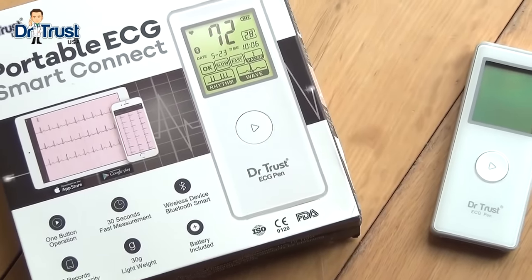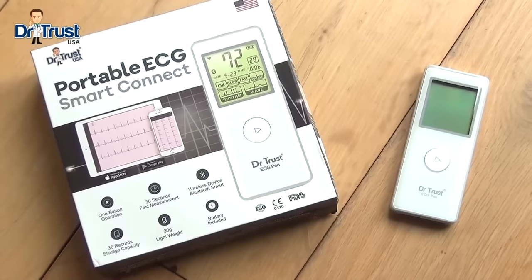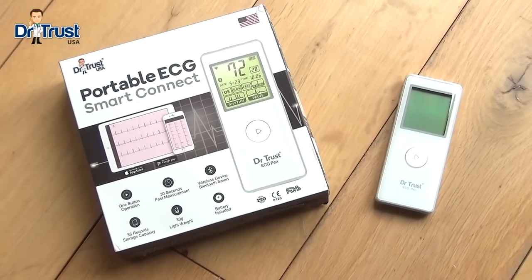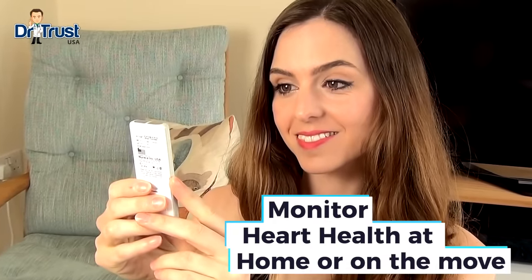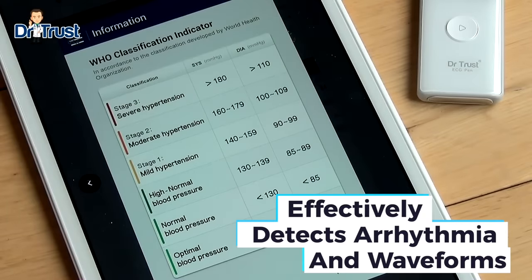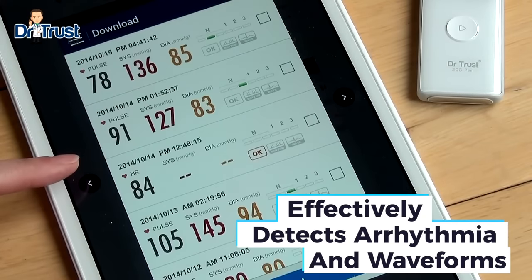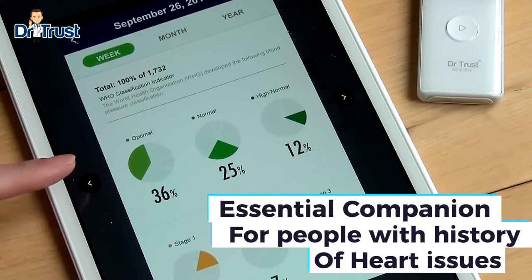Introducing the Dr. Trust Smart Portable ECG Pen — a simple, reliable and effective way to conduct an electrocardiogram. Monitor your heart rhythm easily at home or on the move with this mobile ECG device. As it effectively detects arrhythmia and varied waveforms, it is an essential companion for people with a history of heart attacks or strokes.